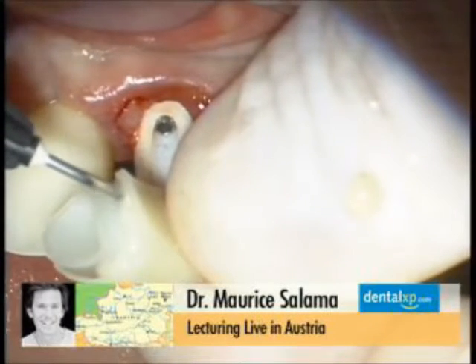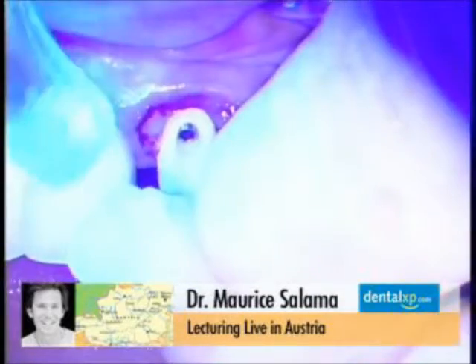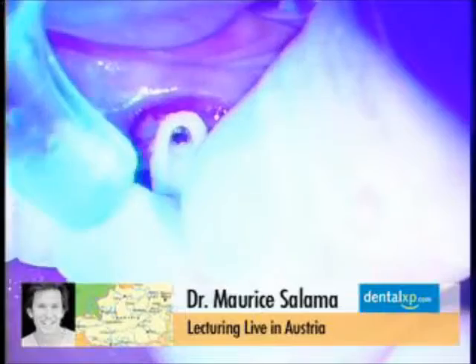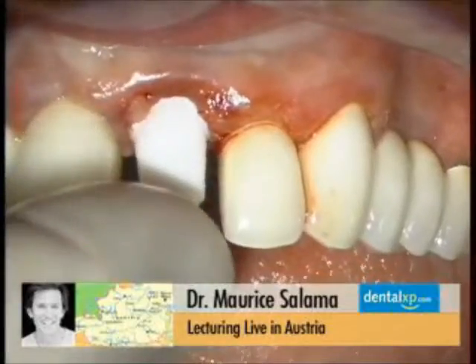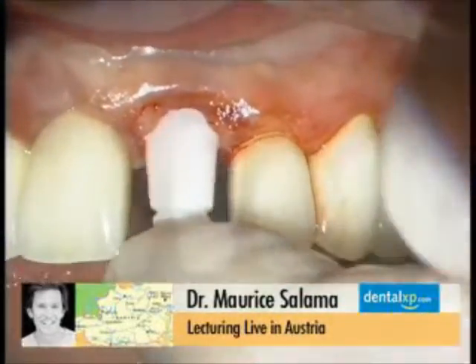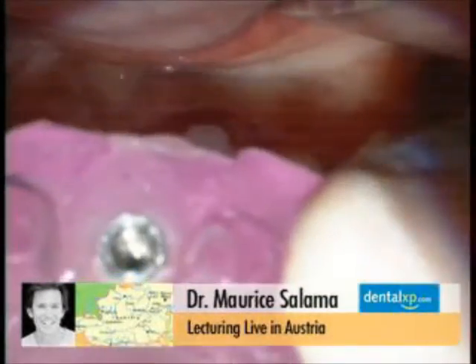You see on this screen, once the soft tissue started to heal, you can see the pontic, in this case where the J-block was, this is now at about 8 months. This is an Ankylos J-block supported papilla, and then another Ankylos implant, and then right next to this is the tooth you're looking at right now on the right screen. Just trying to give you an idea of where this patient came from and where he is now.